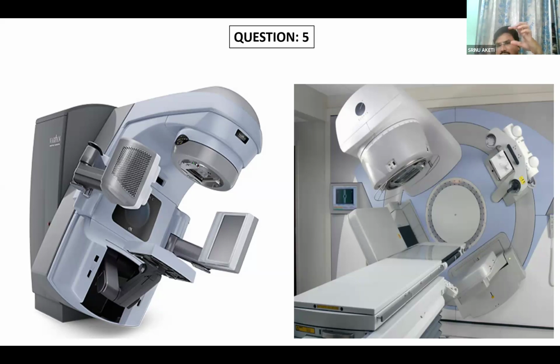So while evaluating your plan, you should understand whether the physicist used the correct beam direction and correct energy or not. Because if they don't know, for example, a junior physicist joined, he's a fresher. You just gave a simple palliative case, where the tumor is at the midpoint. Instead of 15 MV, he selected 4 MV. So it's not good, no?